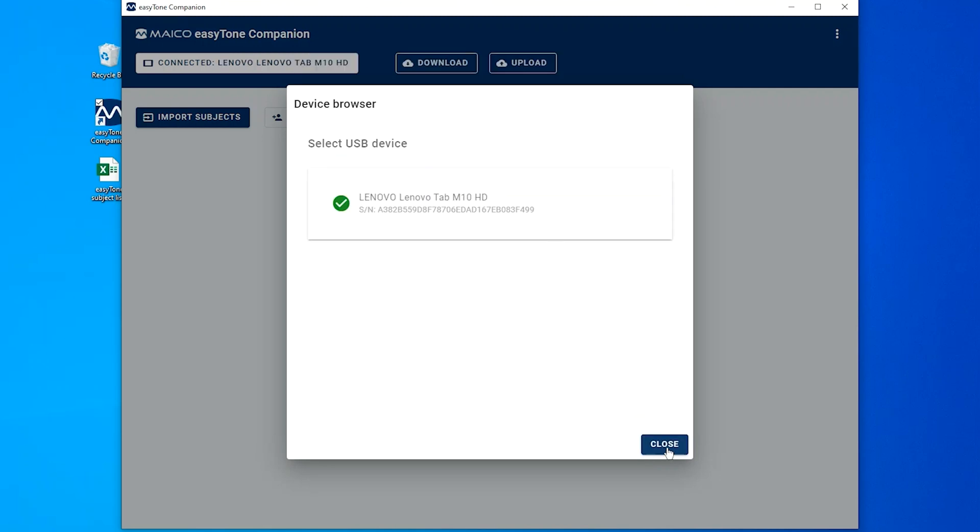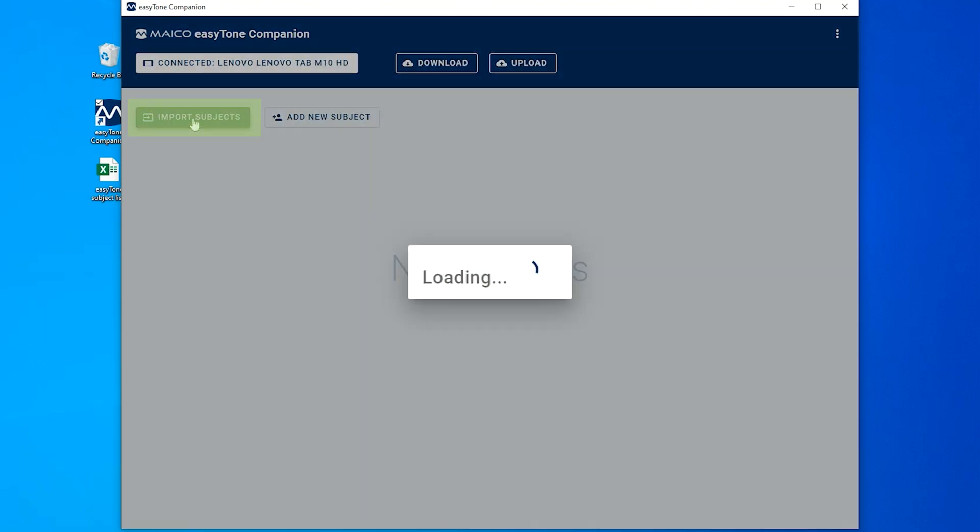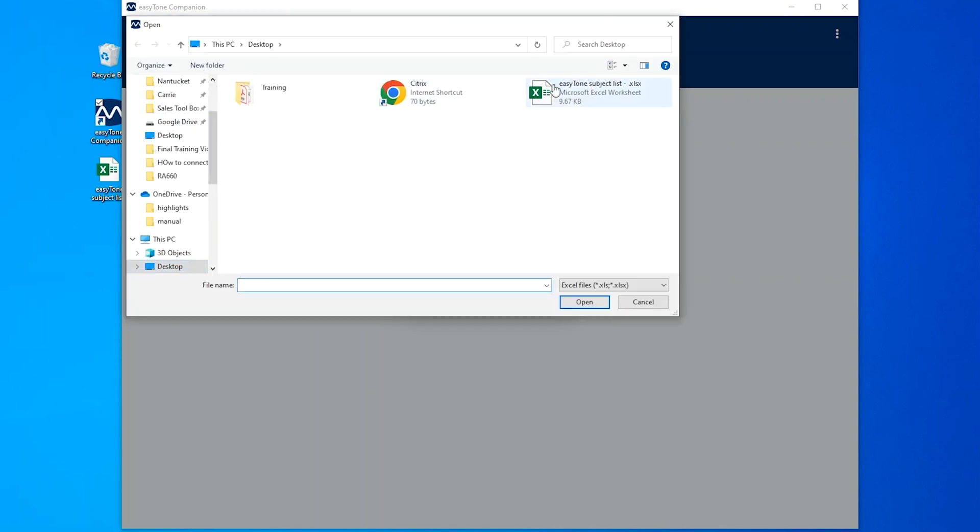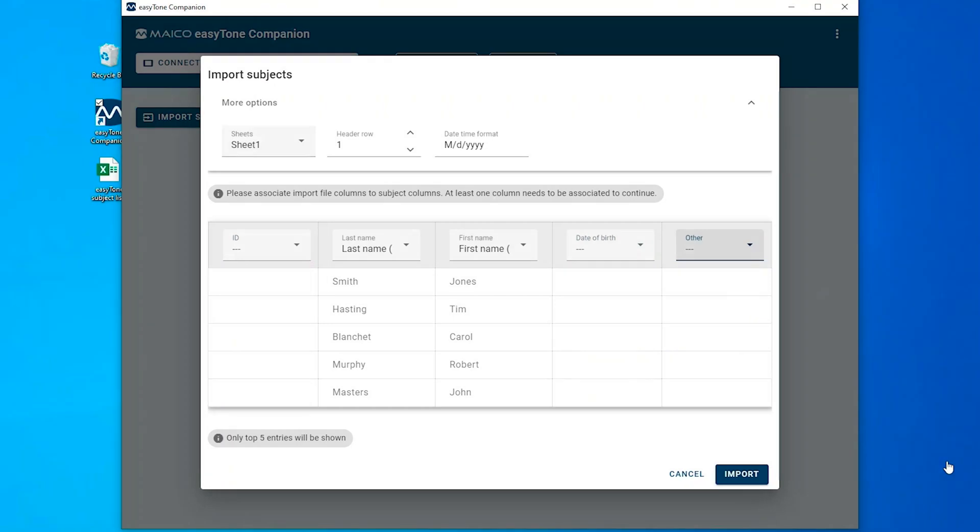Select the Import Subject List button and choose an Excel or CSV file from your computer files. The Import Subject screen will open within the EZTONE companion software.